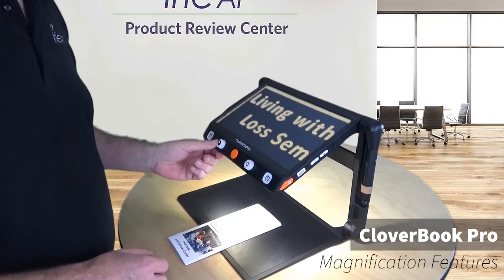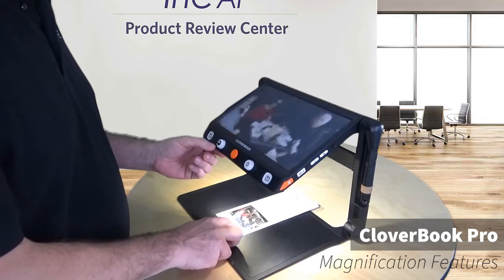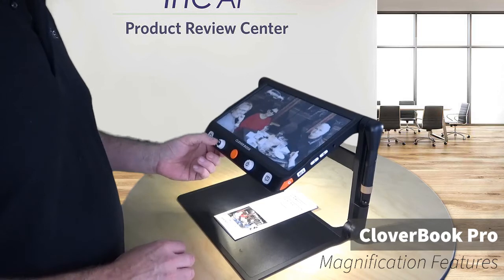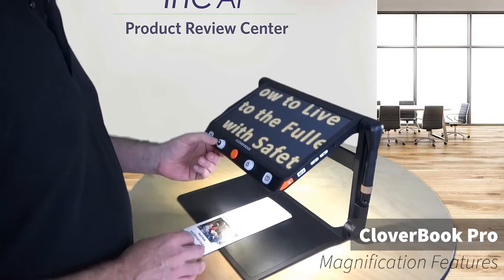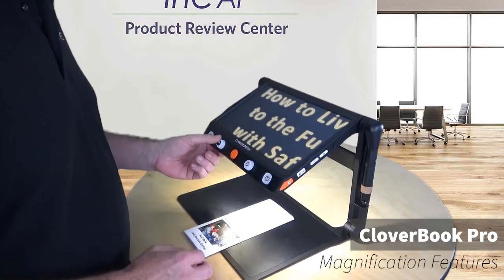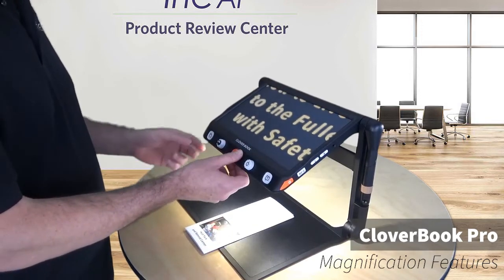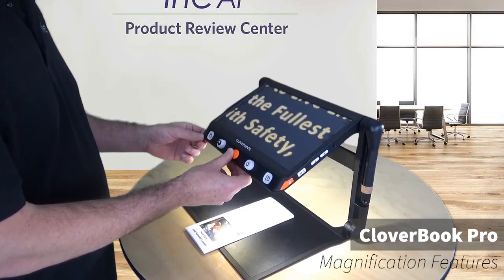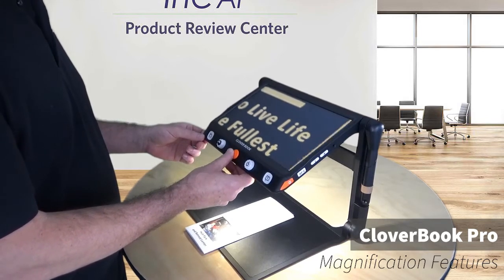Another thing is it also has a push button on this wheel. Because you know you're going to want color sometimes. You're going to look at a photograph or something like that. Sorry, this is a terrible photograph. And then quickly be able to switch back to reading when I get into my favorite reading mode. So you have the wheel for convenience and easily just switch in and out for going between color and your reading. You also have a zoom wheel. You notice I didn't freeze this. I'm able to pan while it's frozen, but I can pan around even when in live view.